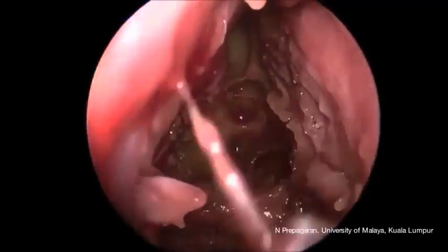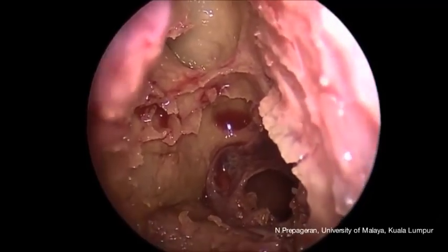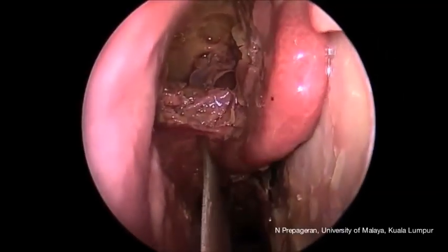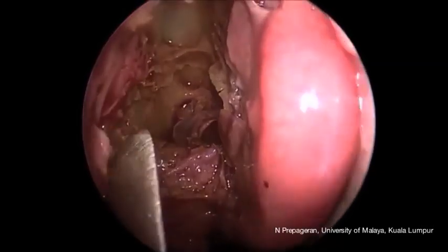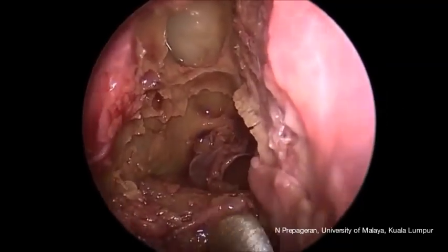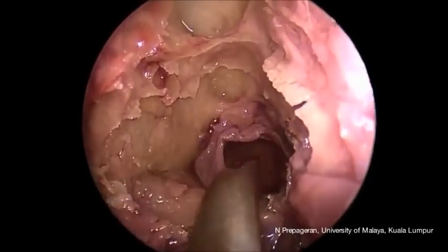Remove some superior ledges of bone, and there, as you can see, the skull base. A bit more mucosa to be removed. Let's look at what is left after a total ethmoidectomy. That's the ground lamella, which is a continuation of the middle turbinate. Again, laterally is the lamina papyracea. We can very nicely see the anterior and the posterior ethmoidal artery, the frontal recess.